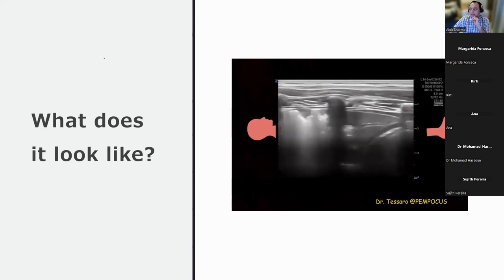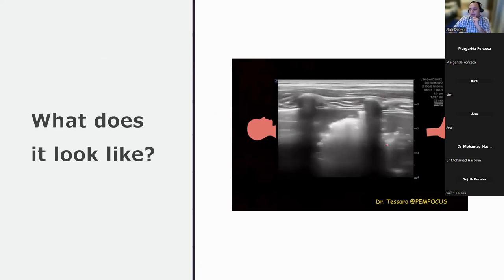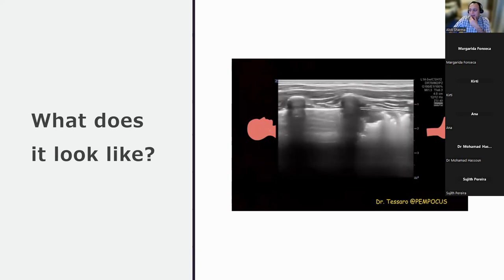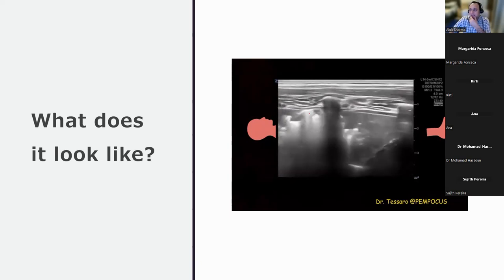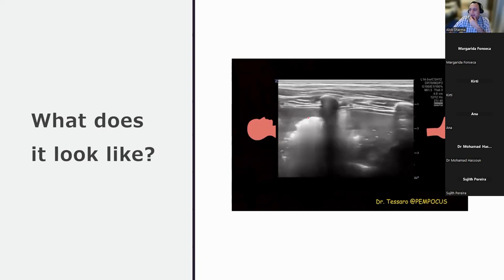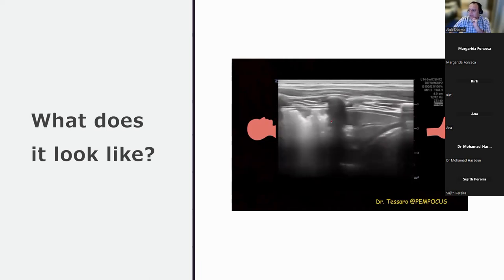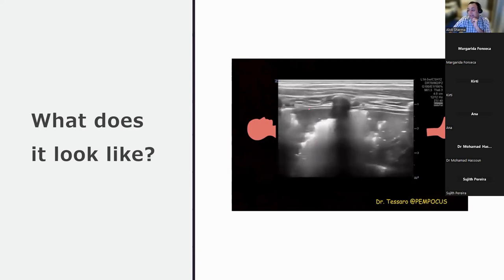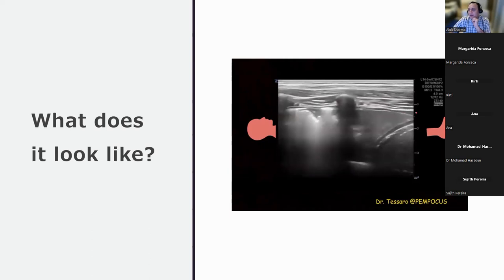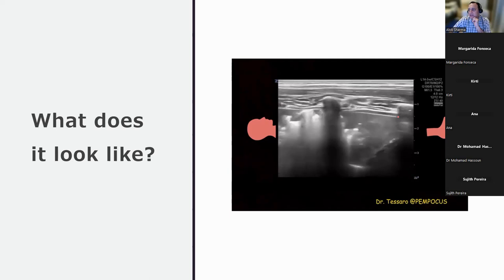Now, I'm just showing you an image over here. And this is a comprehensive image of the lung with the cranial end here and the foot here. What you can classically see at this particular point is normal aerated lung at the top towards the head. And then you have this area of aeration, followed by an area which is extremely irregular, but with a pleural line that's established. This is consolidated lung with irregular margins at the bottom, and this is actually a fractal sign. But as you move right down to the bottom, can you see how you've got a pleural effusion, and this pleural effusion is causing what is called compressive atelectasis? But can you see how sickle-shaped the margin is?